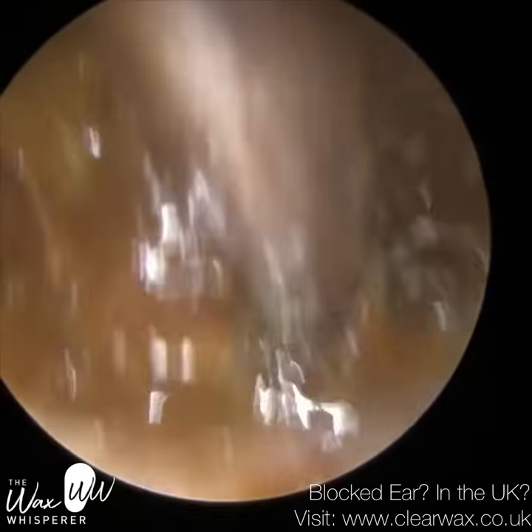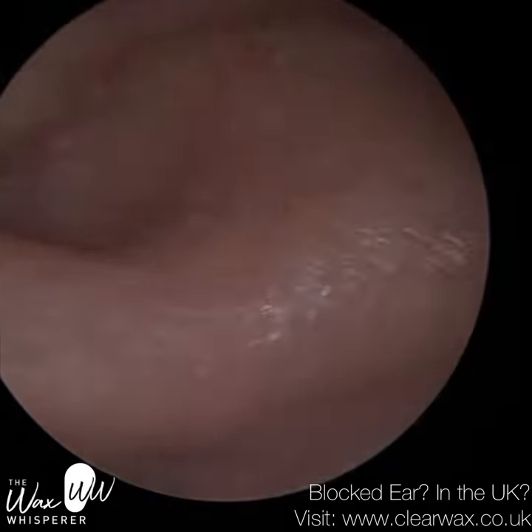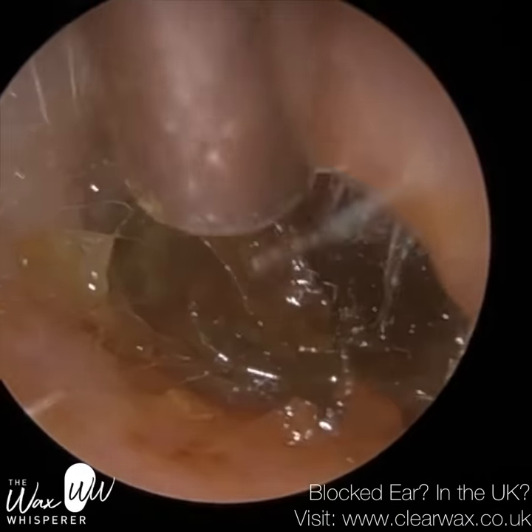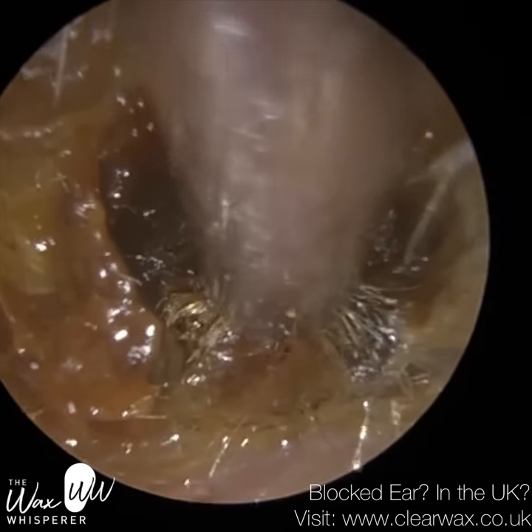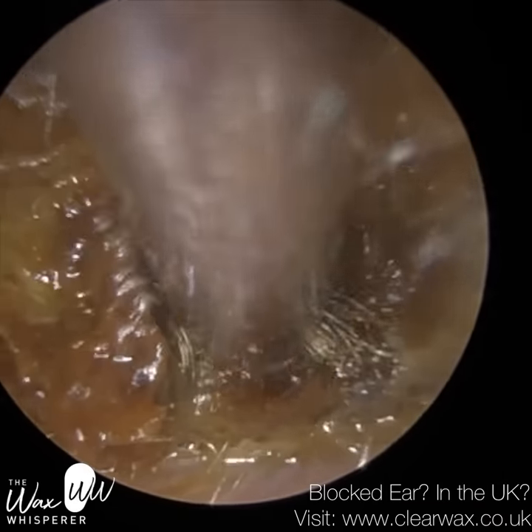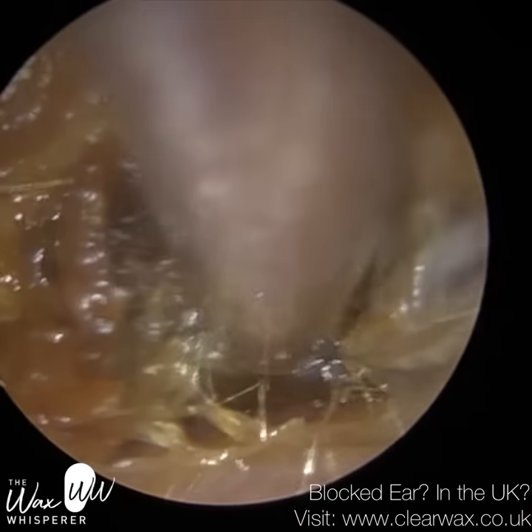Sometimes we just have to take the patient's word, but it was really impacted. This is the indentation here. You can see that circular crater created by something pushing into it.